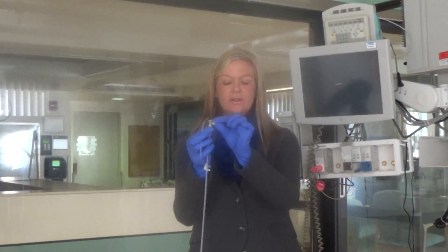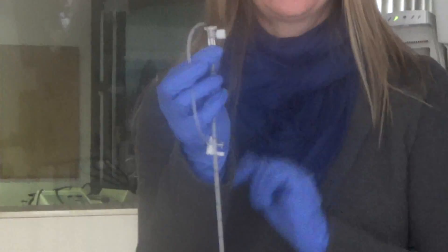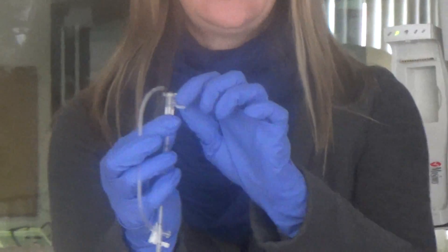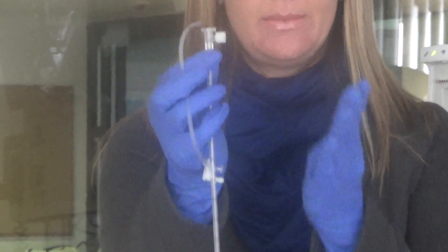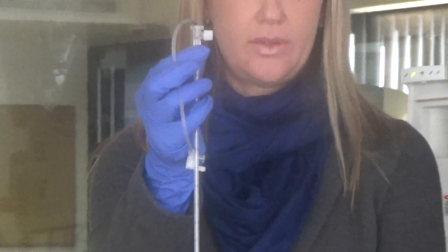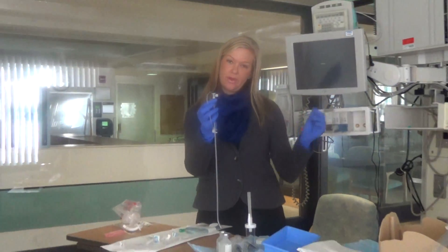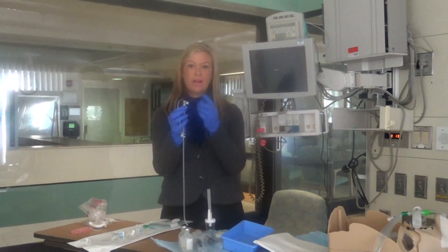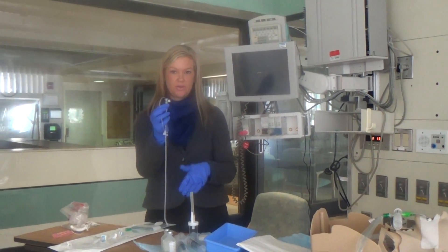Moving up the catheter, there is a supplemental oxygen port, and you'll notice that the port is on the same side as the coude of the catheter. Because this is a completely blind procedure, when your catheter is in the airways, this gives you a nice visual outside of the patient indicating which direction your coude is turning.